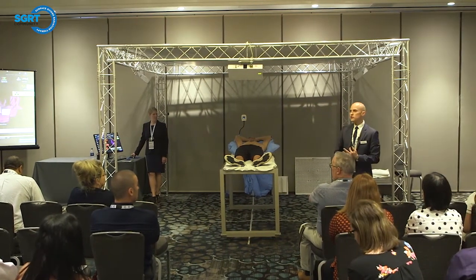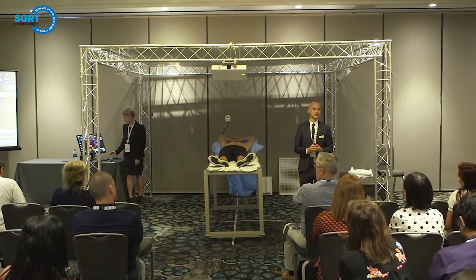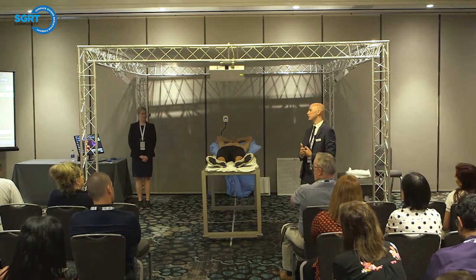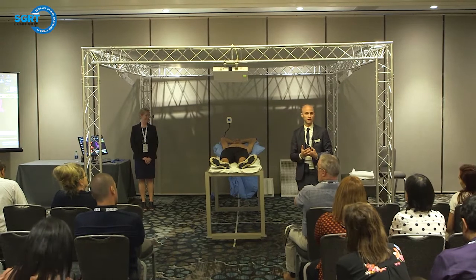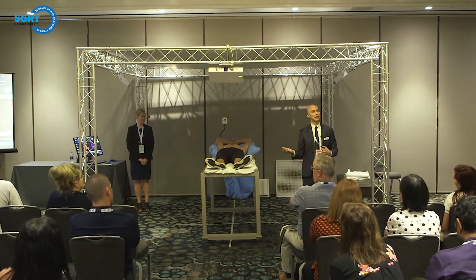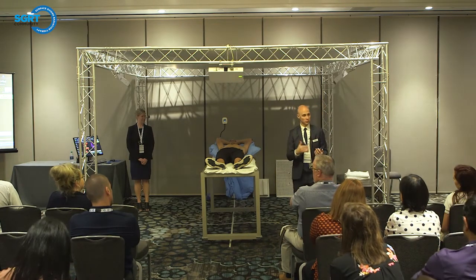Yeah, that's a good question. So deep inspiration breath hold, we live in a day and time where patients love to be involved in their treatments, right? And this gives them the opportunity to do that, and they really do like it. We've had some good patient feedback. With that comes patient education. So you really do, the first day, you need to explain what the device is, what they're trying to do, what they're trying to accomplish, and what you want them to do.